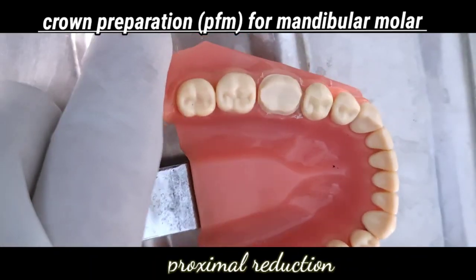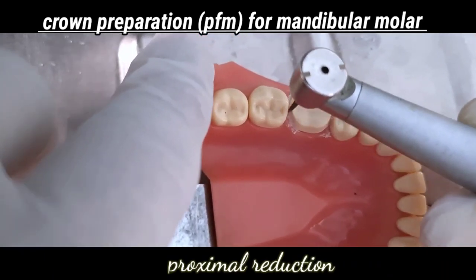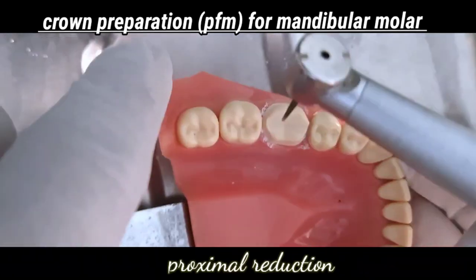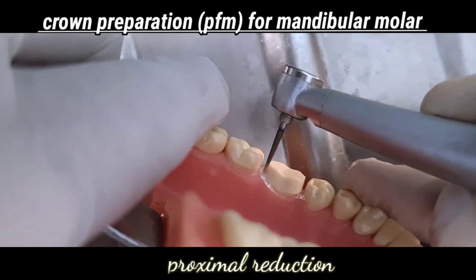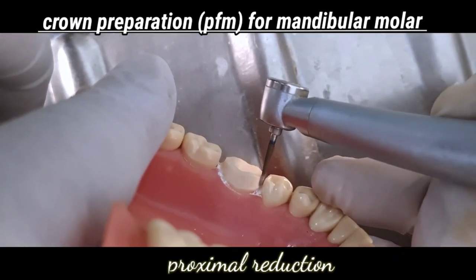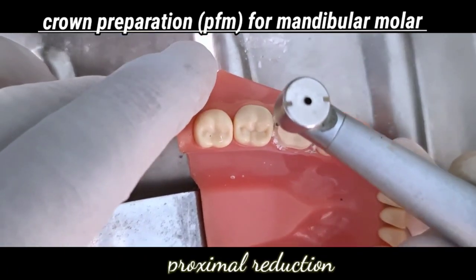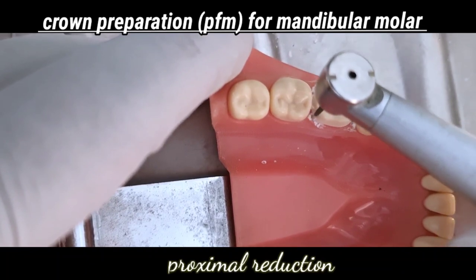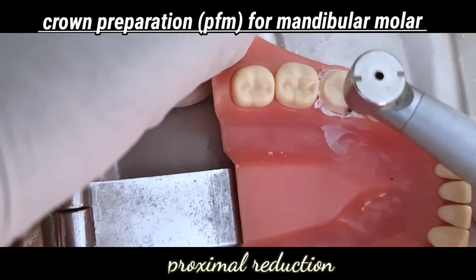So a long needle burr is placed parallel to the long axis of the tooth, slightly above the interdental papilla. It is important to avoid damage to the interdental papilla. So in the posterior it is called the col. And from our perio knowledge, we know it is a non-keratinized tissue which is highly susceptible to infection. So avoid damage to the col.